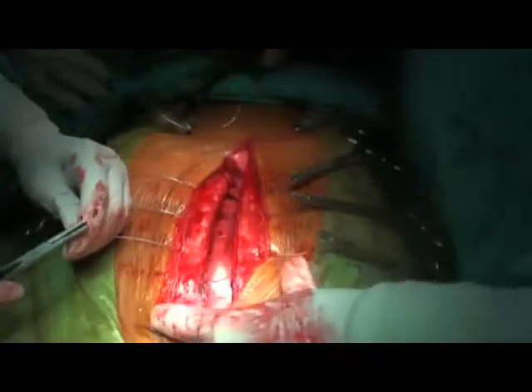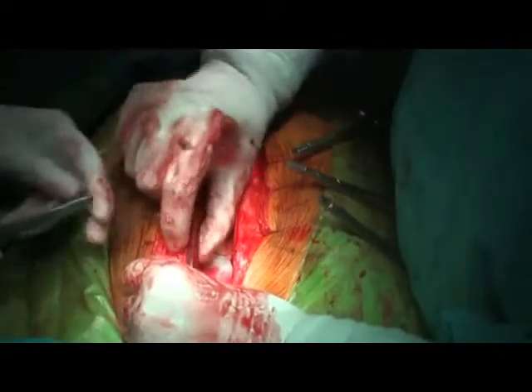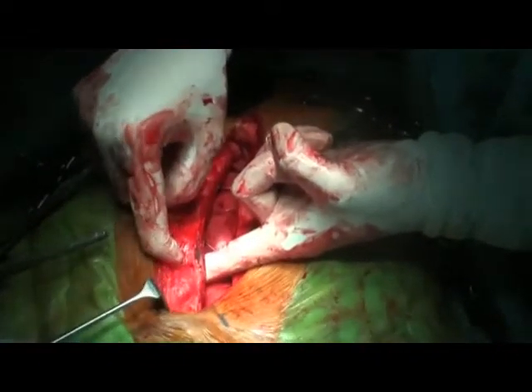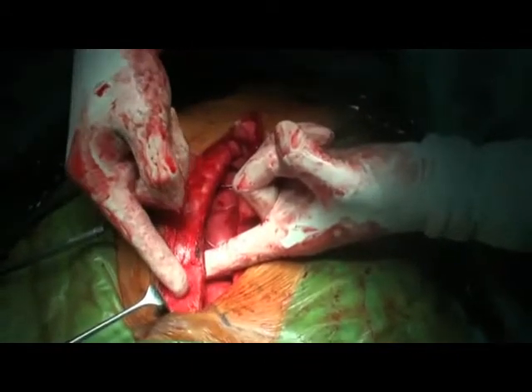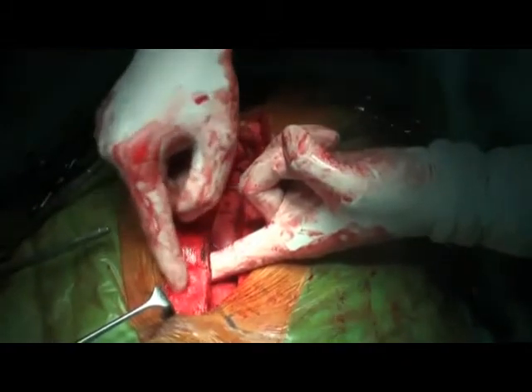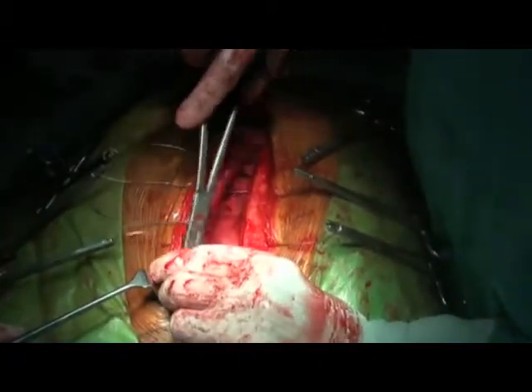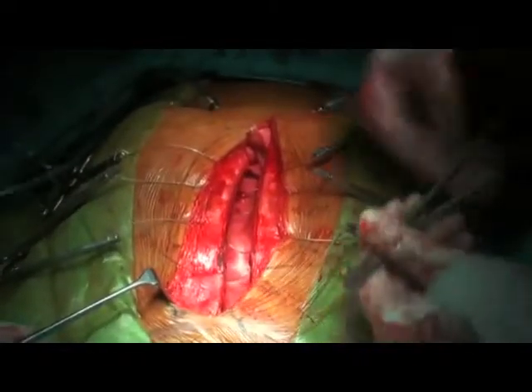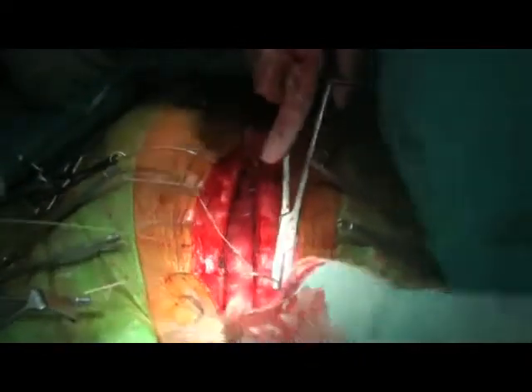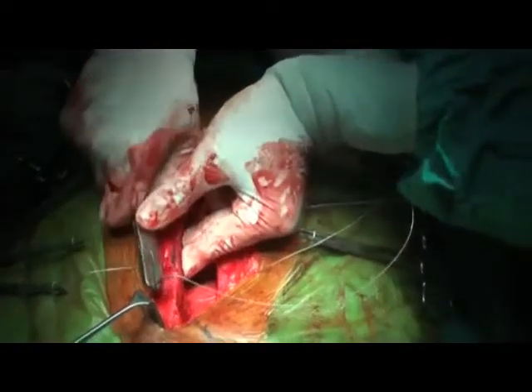At the manubriosternal joint, one should not pass the wires through it because that is the weakest point. In the body of the manubrium, do not try to put wires in the intercostal spaces there because they are very narrow and can damage the internal mammary artery — always pass the wire through the body of the sternum. The same rule applies: pass your needle vertically rather than tangentially, because tangential wires will cut through. For this small patient, I am using only two wires through the body of the manubrium; for a heavier patient, I would use three.